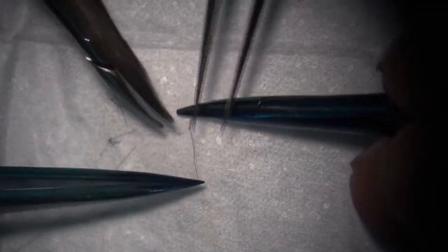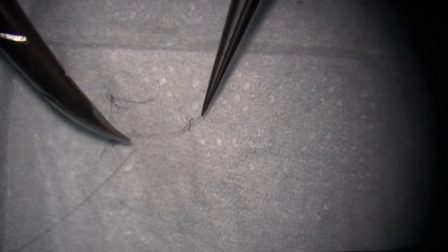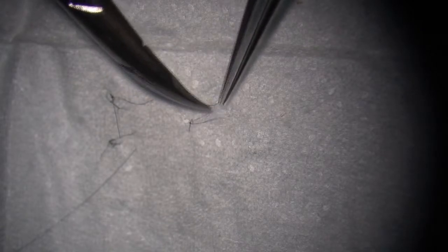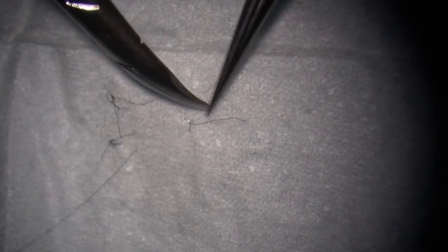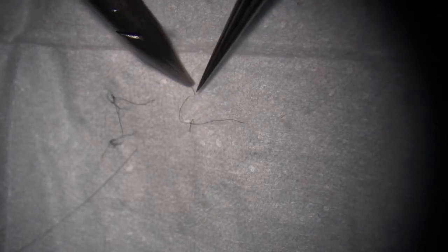In this situation, because the forceps is smaller, we would like to use the forceps to make the loop, so we can use a shorter segment of the suture, right? If we hold this one and the needle holder is big, it's hard to. It interferes. Yeah, so that's some of the tips.